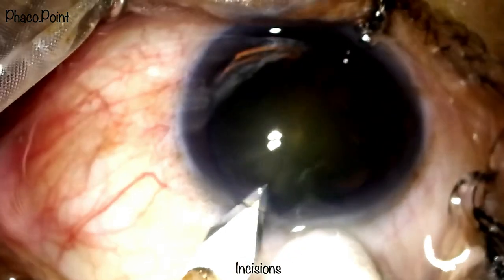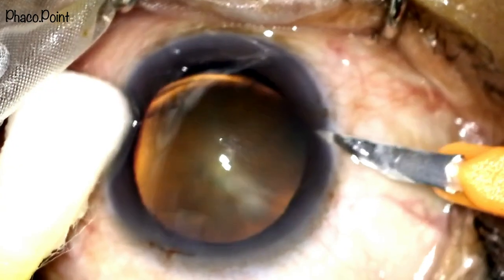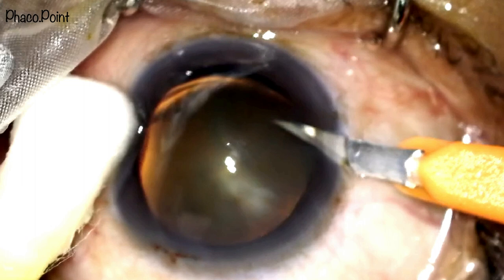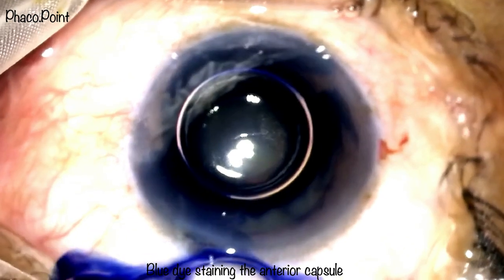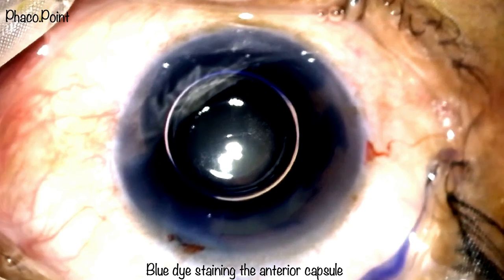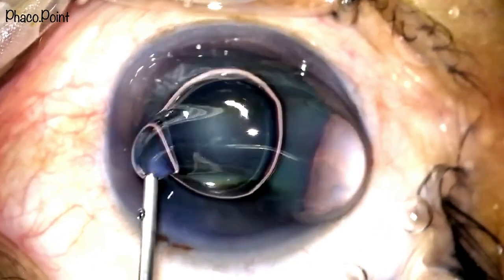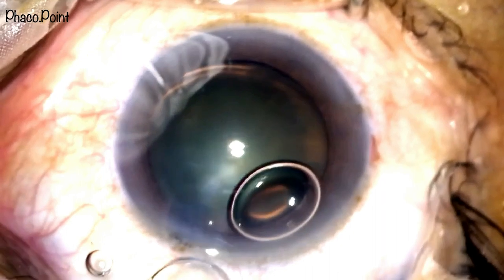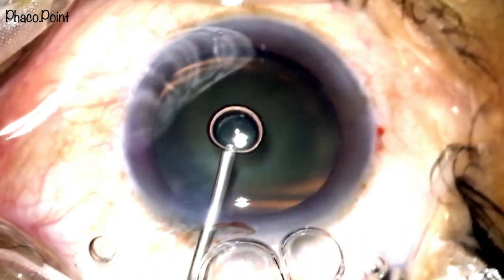We need to be extremely meticulous while creating both the main incision and the paracentesis incisions — you don't want difficulty manipulating instruments, nor an incision so large it causes unwanted shallowing of the anterior chamber. In view of the existing zonular dialysis, be cautious about how much blue dye is injected; just a few drops onto the anterior capsule is adequate. Washing out excessive blue dye must also be done gently. The anterior chamber is then insufflated with viscoelastic, and all air bubbles must be removed to ensure visibility during the capsular rhexis.